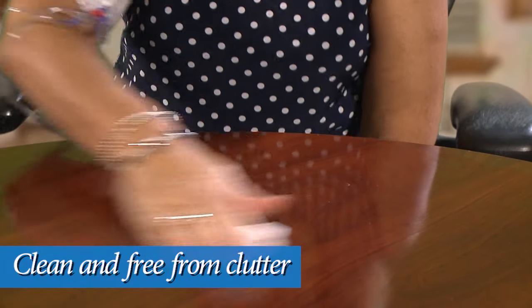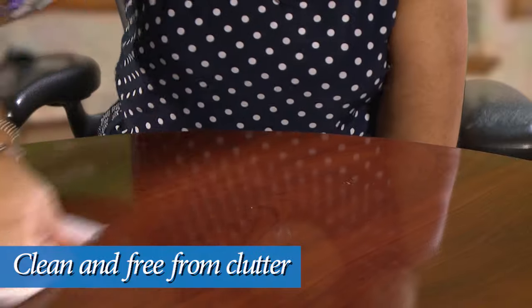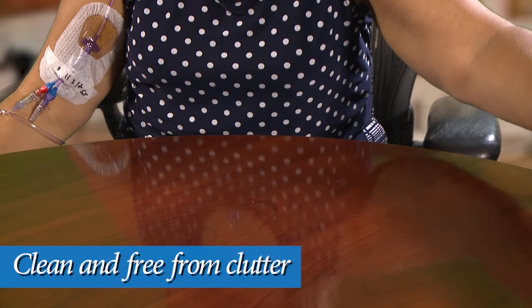To begin, it is very important to have a clean surface to put your supplies and IV medicine on. Choose a place that you can easily clean and that is free from clutter. Clean this area well using soap and water.